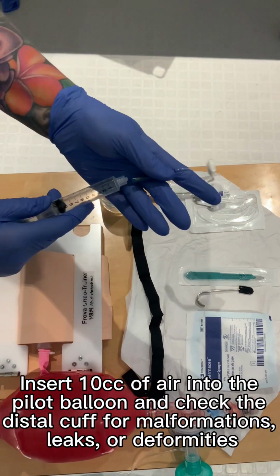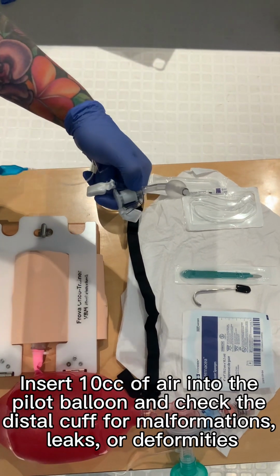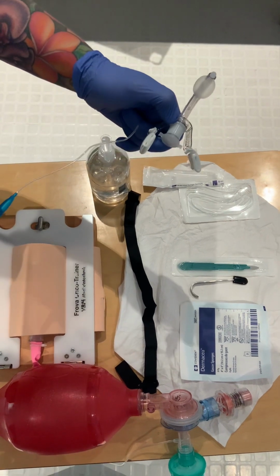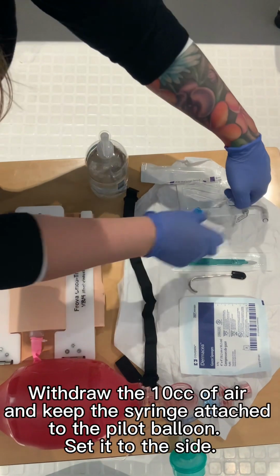Insert 10 cc's of air into the pilot balloon and check the distal cuff for malformations, leaks, and deformities. Withdraw the 10 cc's of air and keep the syringe attached to the pilot balloon. Set it to the side.